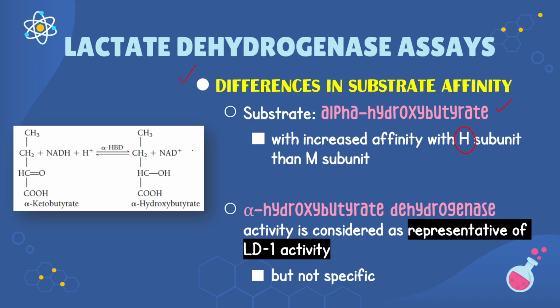The enzyme that represents LD1 activity is alpha hydroxybutyrate dehydrogenase. Again, this enzyme is considered a representative of LD1 activity. Earlier, what was written above is just your substrate.